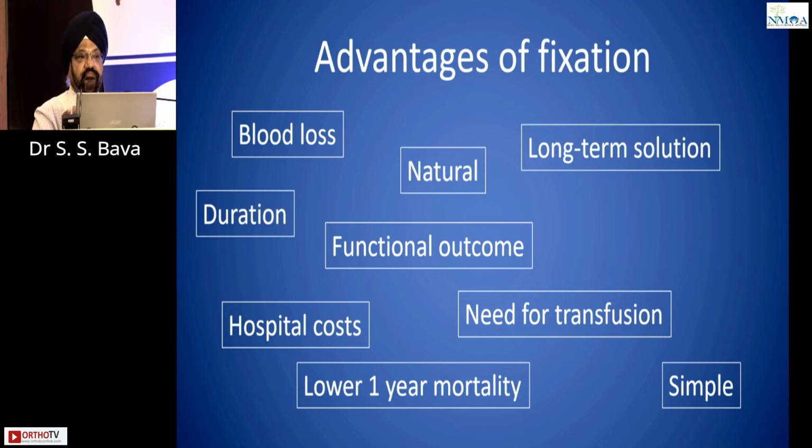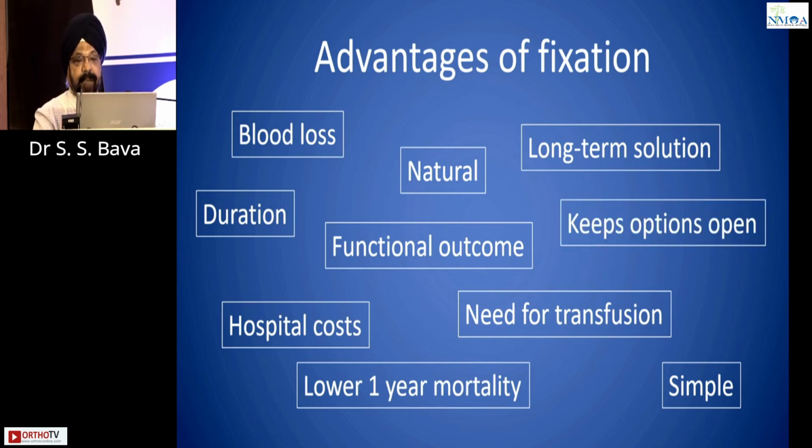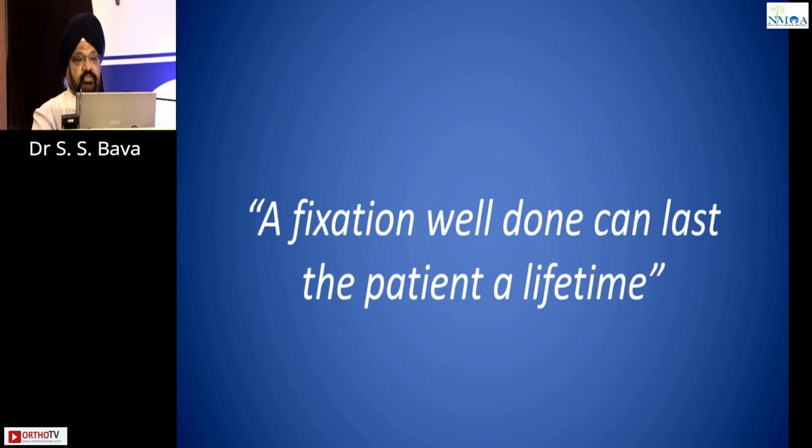The surgeon can finish the case in 15 to 45 minutes. And you keep your options open. If anything fails or there is a complication, you can do something for that. So a well-done fixation can last the patient a lifetime.